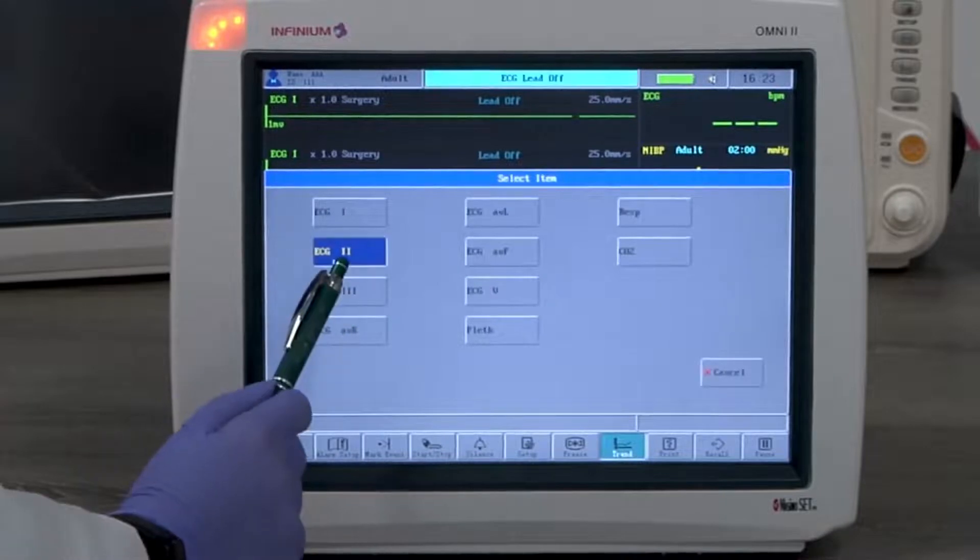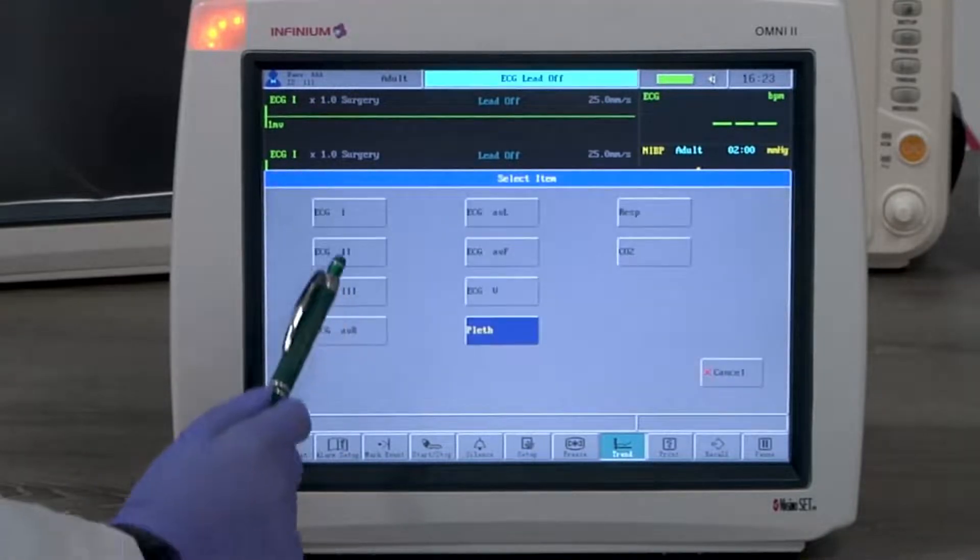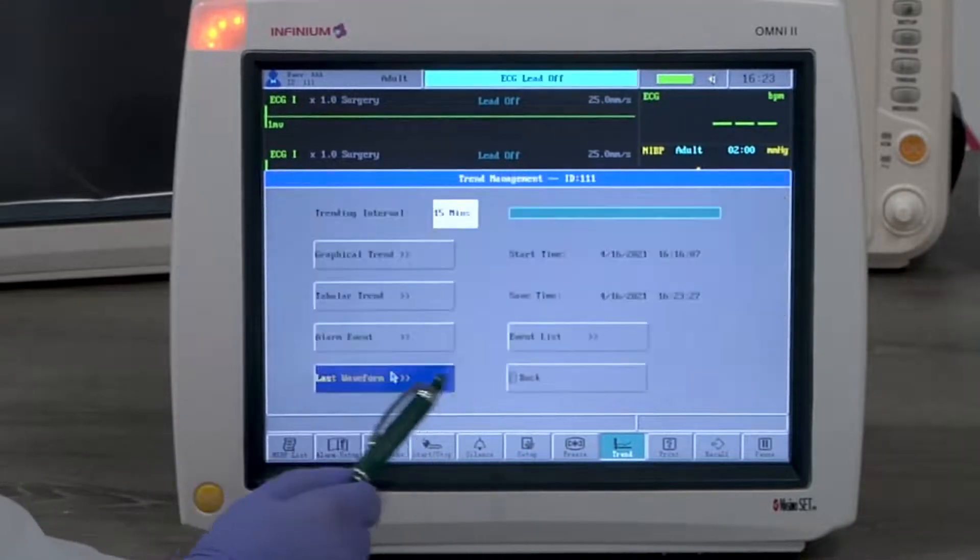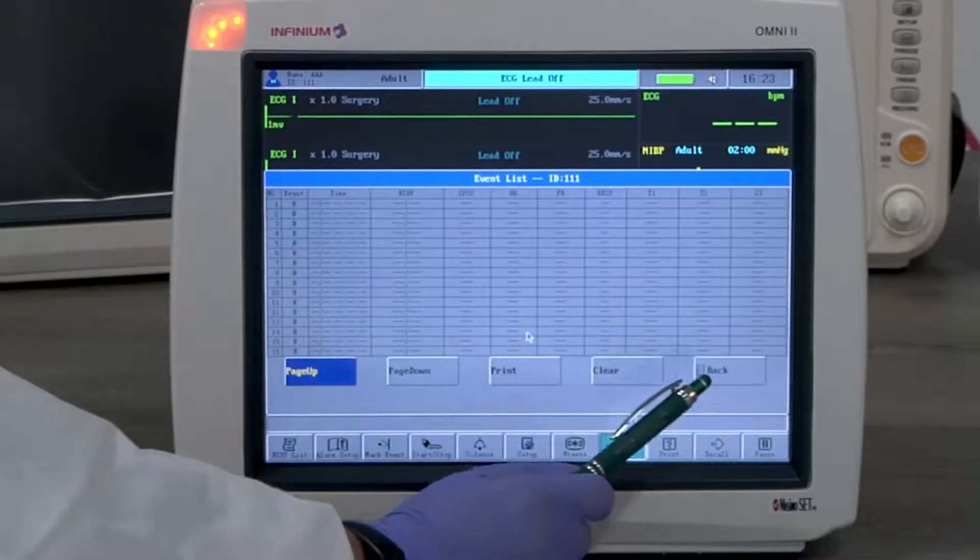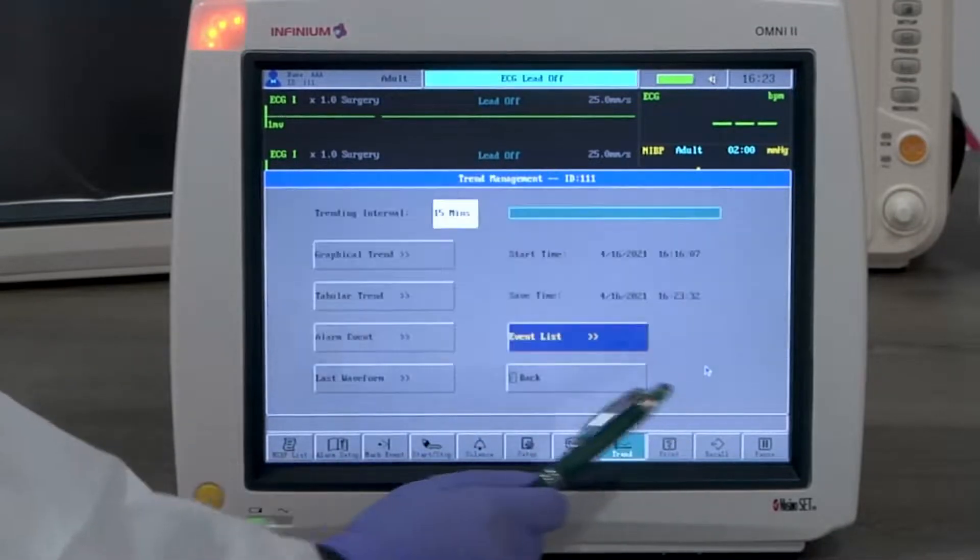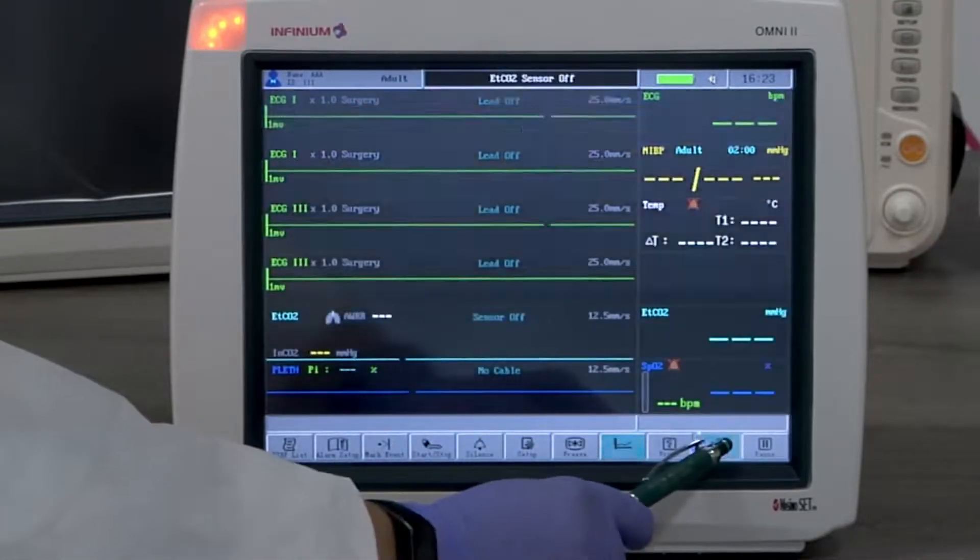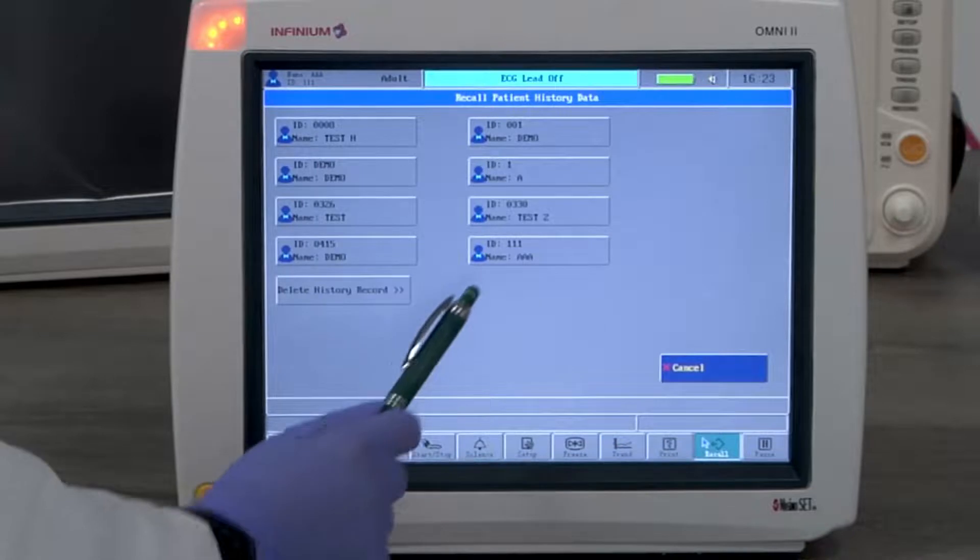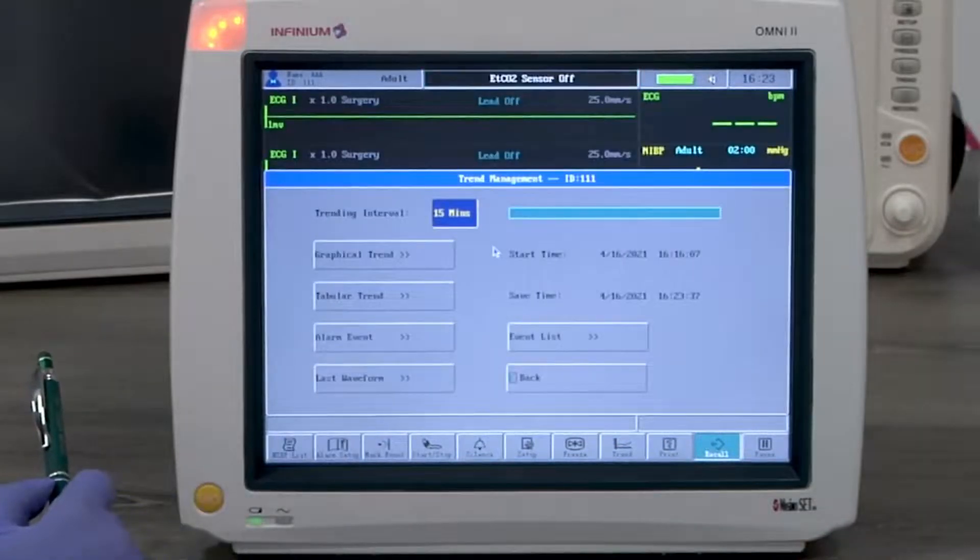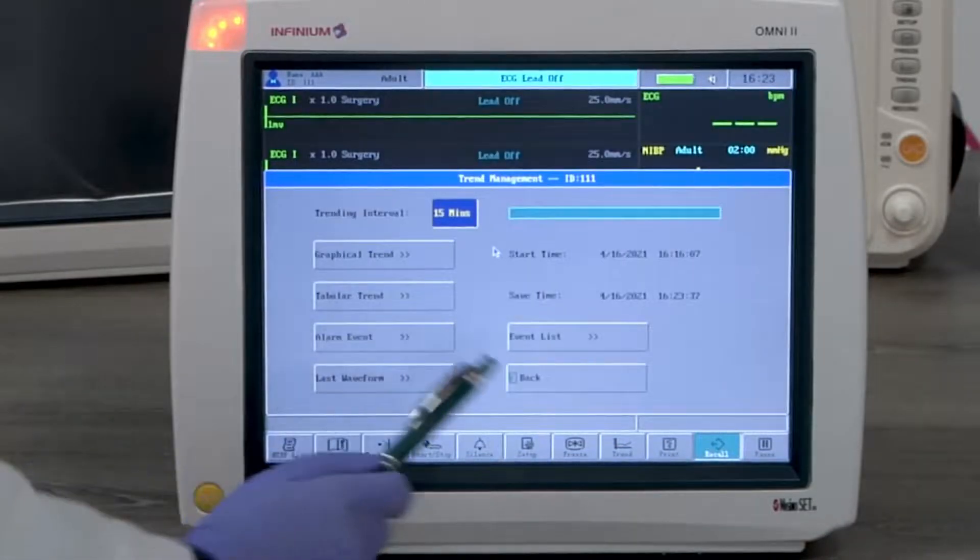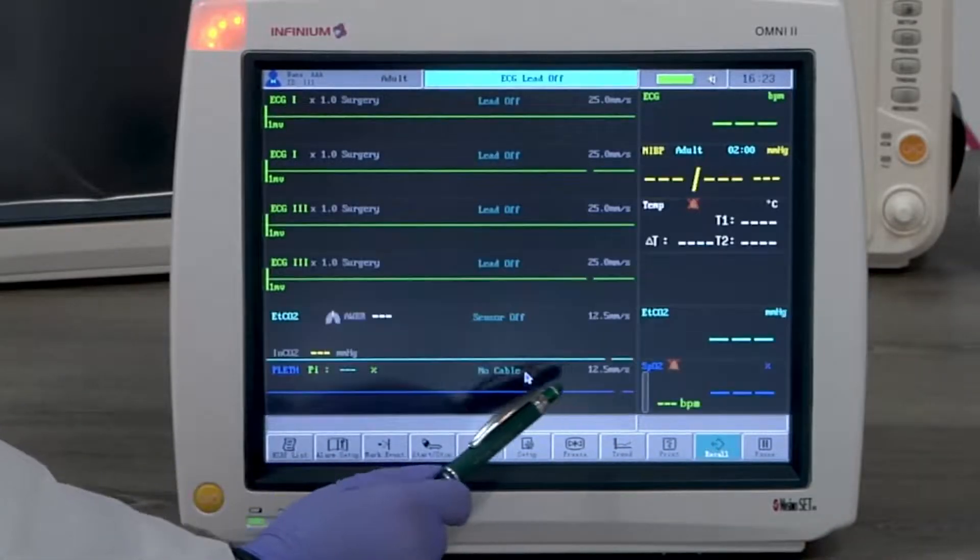Event list shows the list of standard parameter readings under each marked event. Recall button will bring up stored patients for the user to review their trend data. The monitor can store a maximum of eight patients. Entering a ninth patient, however, will automatically delete the first patient.